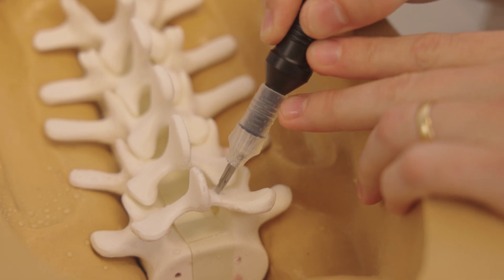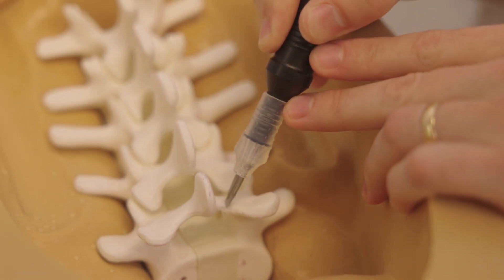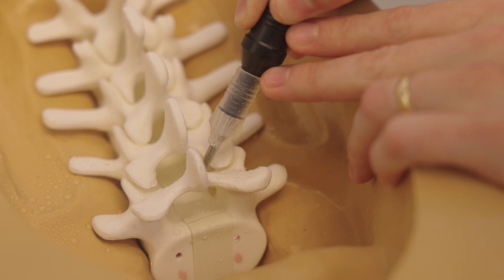As you can see, the blade vibrates at a high frequency, enabling it to cut bone efficiently. The built-in irrigation system ensures that the blade stays at a cool temperature, preventing excessive heat buildup and maintaining safety throughout the procedure.